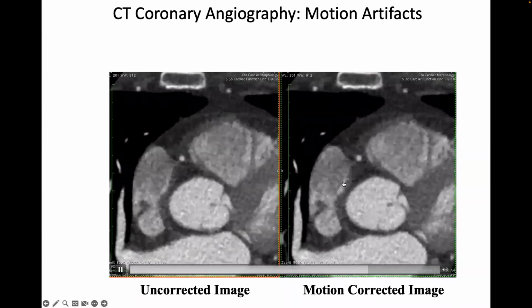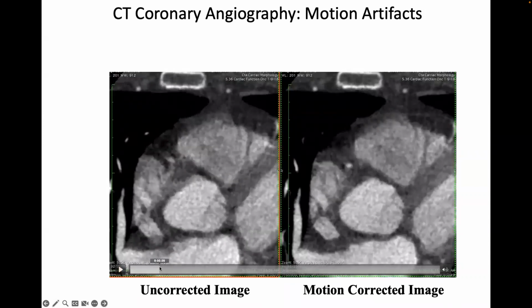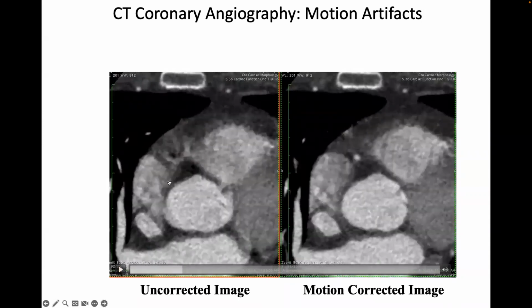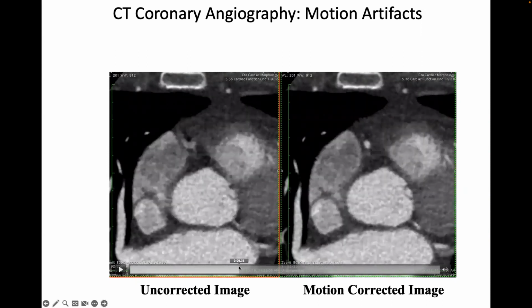Here we go. Okay. We can look at individual frames here. As we go through, you can see the coronary itself is essentially not visible in the uncorrected picture. There's a big dark hole here that's like a negative signal, where the coronary sort of left this area, right? Whereas in the corrected data, you have a coherent coronary signal at almost every phase. Here it's in some kind of cycloid shape. Here it's taken that into account and mapped it into its correct location.